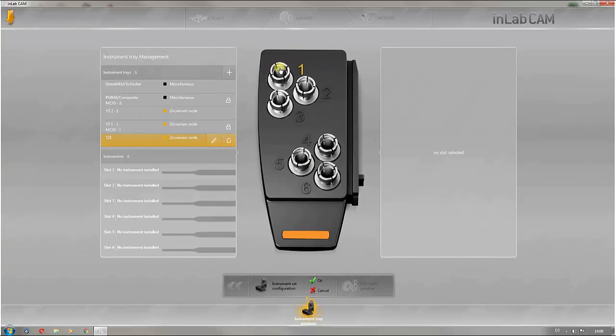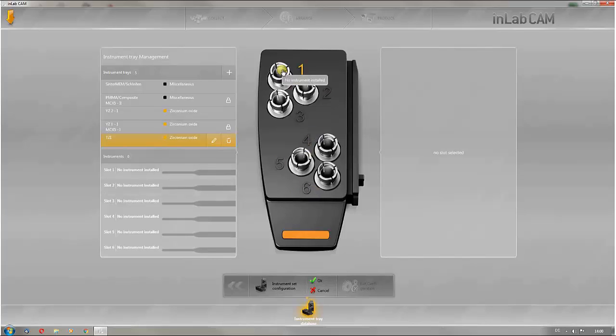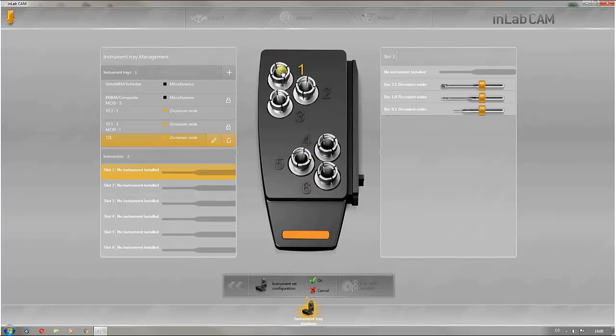Next, you can equip the tray. There are six positions available in the machine. Click on the tools to select them and assign them to the positions in the instrument.